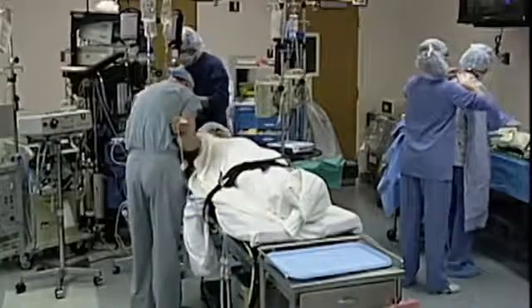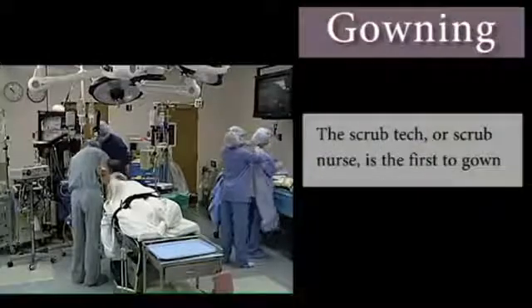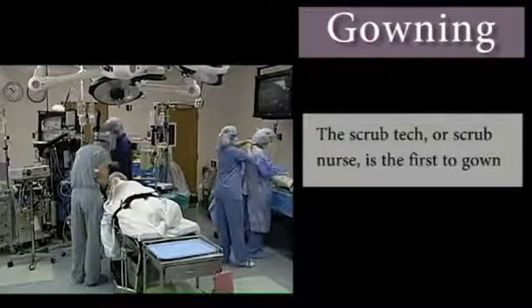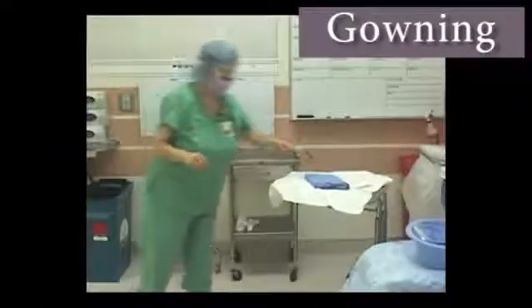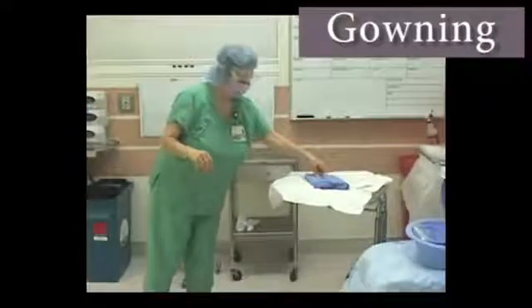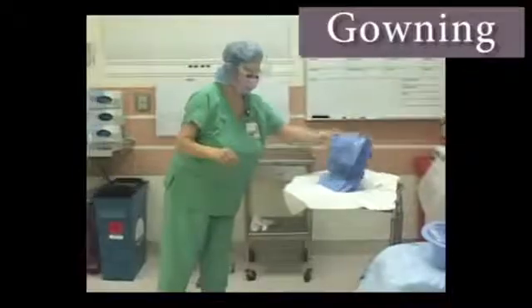The scrub tech, or scrub nurse, is the first to gown. Prior to sterilization, gowns are folded so they will unfold lengthwise with the sterile side out.